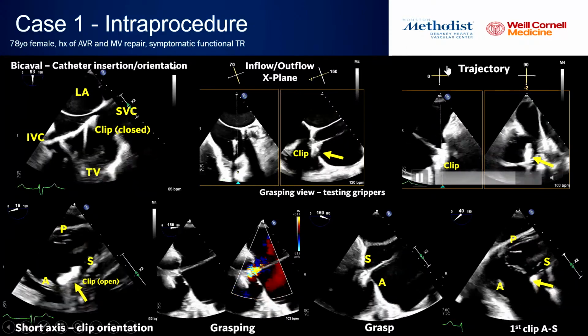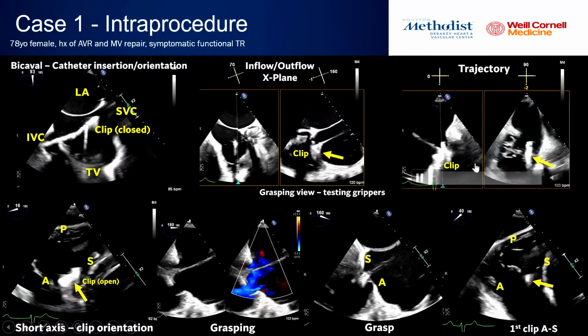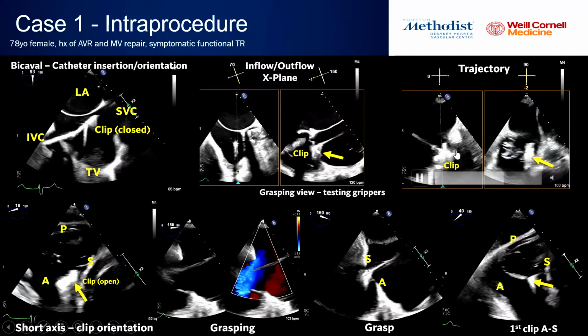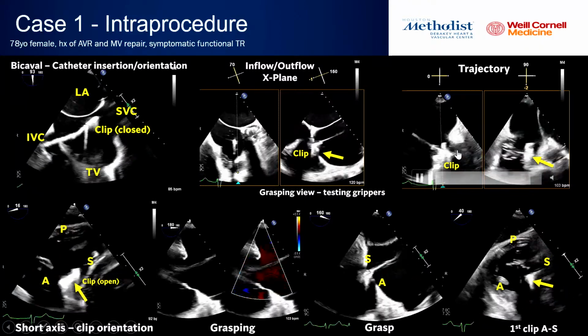And on the right here, we're gonna also assess the trajectory of this clip to see that when we advance, is it gonna change direction, or are we on the right direction, etc.